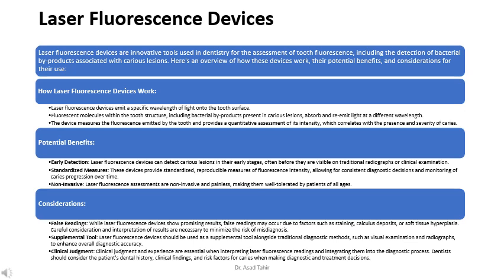Supplemental tool. Laser fluorescence devices should be used as a supplemental tool alongside traditional diagnostic methods, such as visual examination and radiographs, to enhance overall diagnostic accuracy. Clinical judgment. Clinical judgment and experience are essential when interpreting laser fluorescence readings and integrating them into the diagnostic process. Dentists should consider the patient's dental history, clinical findings, and risk factors for caries when making diagnostic and treatment decisions.